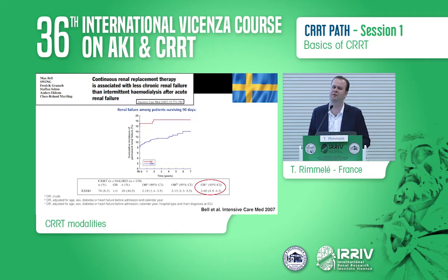But now we have a new outcome, for the last decade, I would say, that is very important. Now we tend to look at renal recovery after severe acute kidney injury. And when you look at the renal recovery after severe AKI, there is growing evidence of an association between the use of CRRT during the first days of the ICU stay and a better renal recovery.